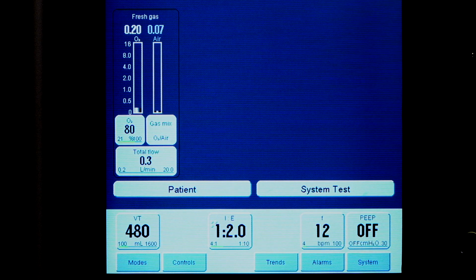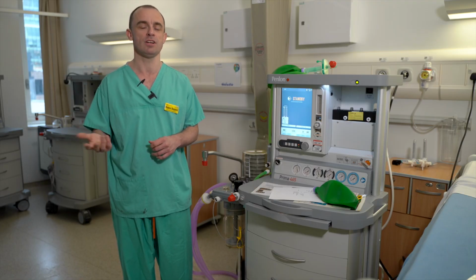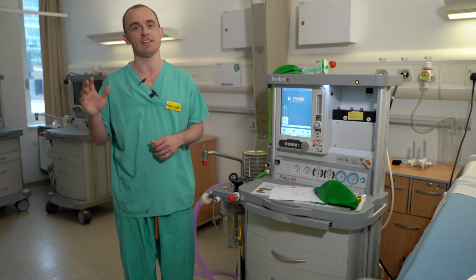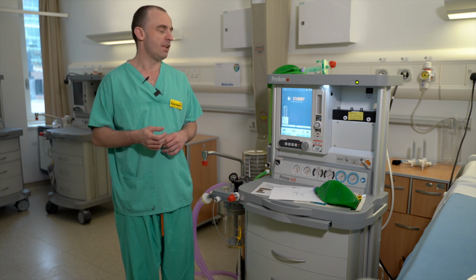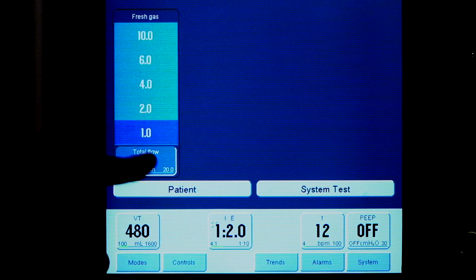The last thing to set is the total flow. So the ventilators that we use on intensive care adapt to the patient's minute volume. So if you set a higher respiratory rate and a higher tidal volume, and by that increased minute volume, you'll see that the ventilator will give more gas. Anaesthetic machines don't work like that, and so therefore you have to set what you want the total flow to be.